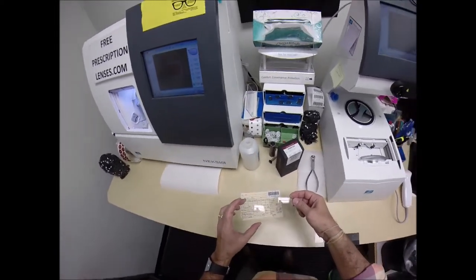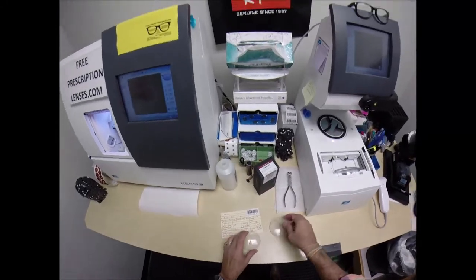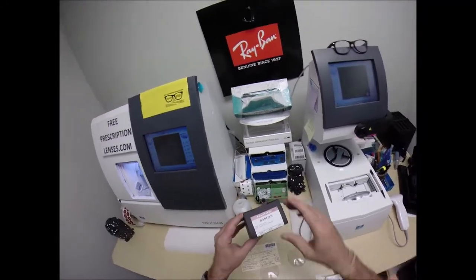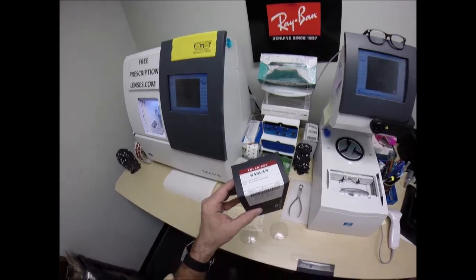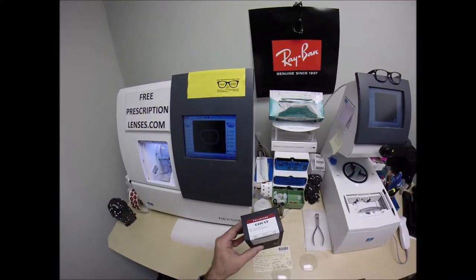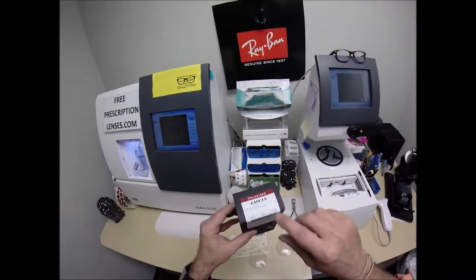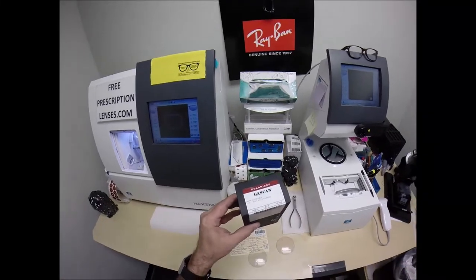So you don't have to take reading glasses on and off all day while you're working. I'm going to install them into the Oakley gas can, model number 9014, color 856, 60 eye size with a 15 bridge.